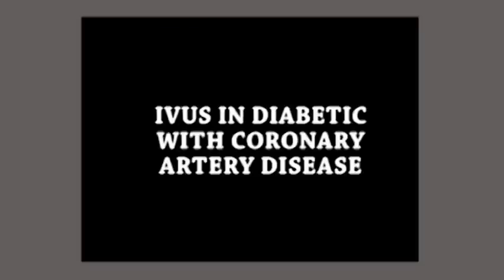The virtual histology and the grayscale on the IVUS would give me information on the plaque burden and its components — fatty, fibrous, fibro-fatty, or calcification — and help decide on the treatment modality in this diabetic patient with intermediate stenosis.